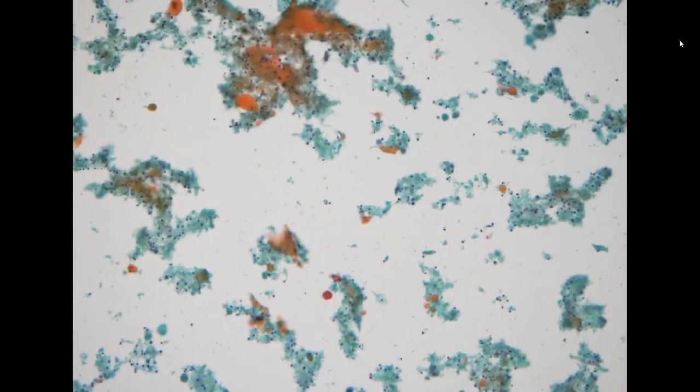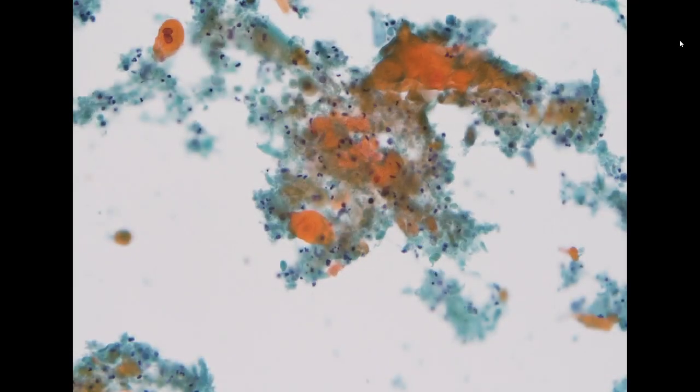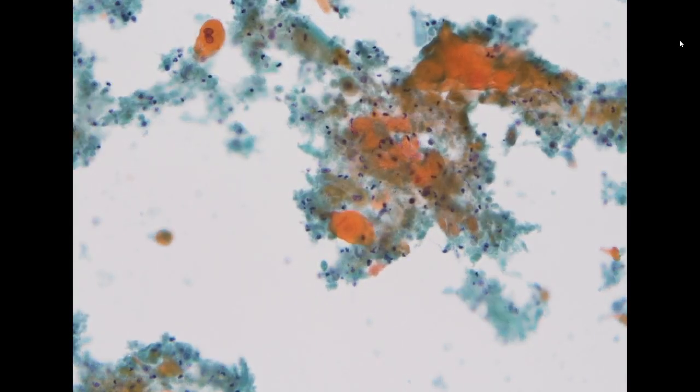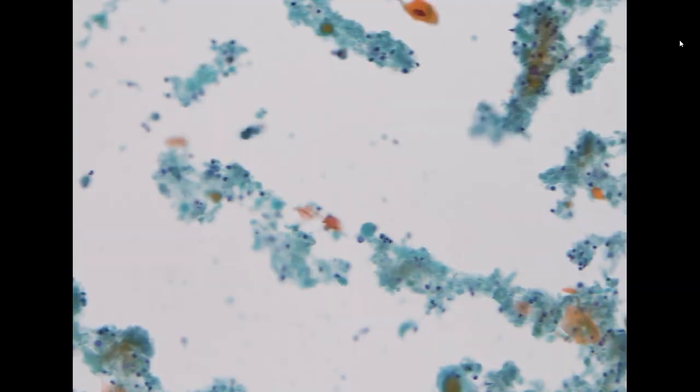He also received a soft tissue mass aspiration with a lot of fluid. So this is from the side, from the soft tissue of the side. And they were ruling out soft tissue metastasis. So here we also see similar morphology with keratinized squamous cell carcinoma. So this is also positive for metastatic SCC.